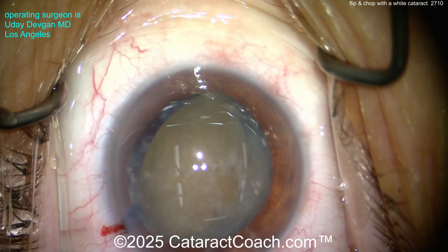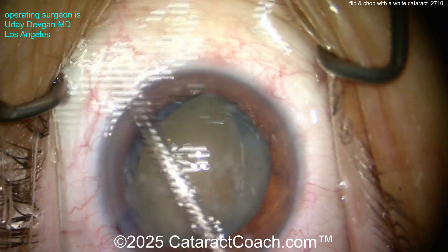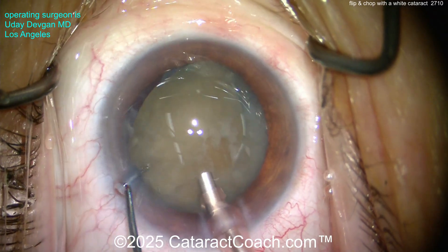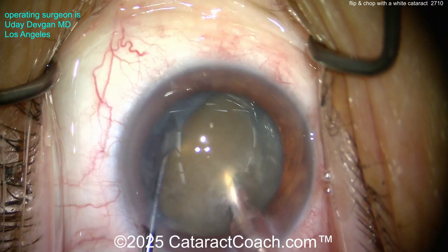Now a small aliquot of dispersive viscoelastic to recoat the central endothelial cells and protect that cornea. Phaco probe going in the eye. The key is you've trapped the nucleus between the phaco probe and the chopper. Probe goes in the eye — high vacuum, higher flow settings, get a good amount of power in there too. Buzz in the center; vacuum and power to hold it. The nucleus is now trapped.